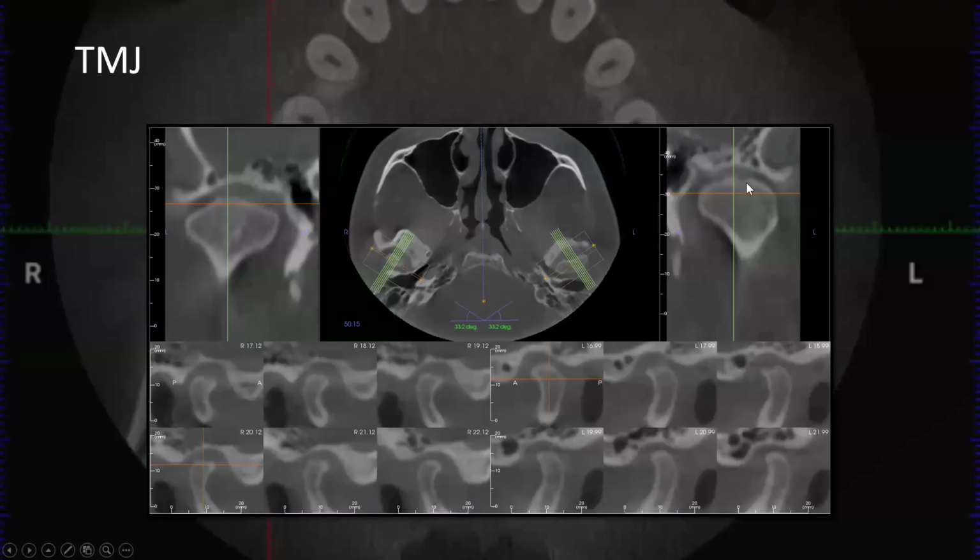You see a little bit of a concavity here. There's a little bit of an erosion lesion. So that's one of the signs of osteoarthritis, potentially leading to patient symptoms. You look for osteophytes, which is kind of sclerotic bone formation on the surfaces, on the articular surfaces of bone. And this is a really common place to see it, on the anterior of the condyle. And so a couple different signs of osteoarthritis. This one shows probably a little sclerosis and osteophyte formation.